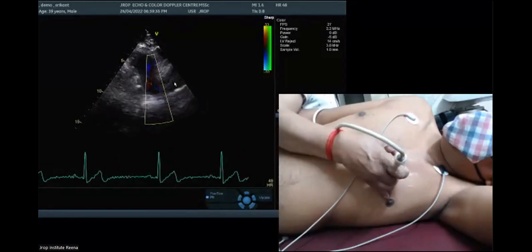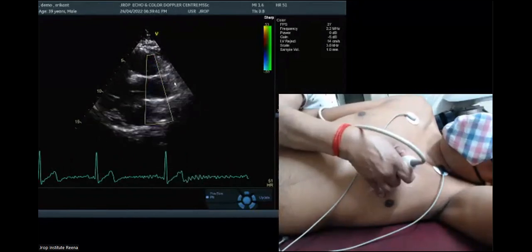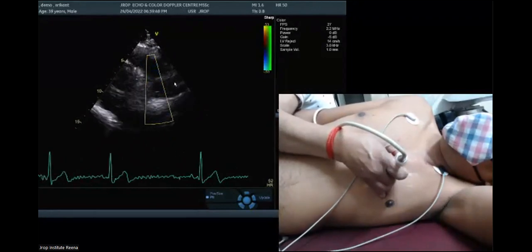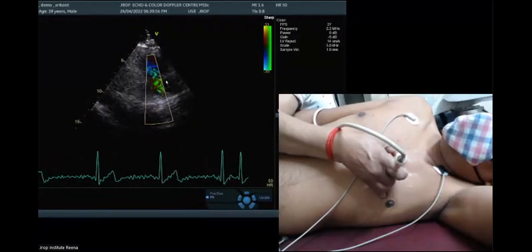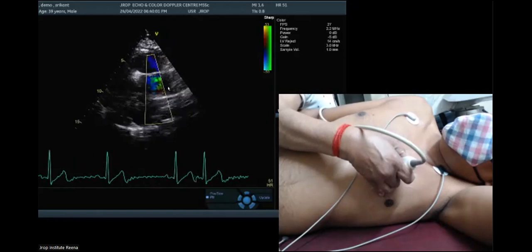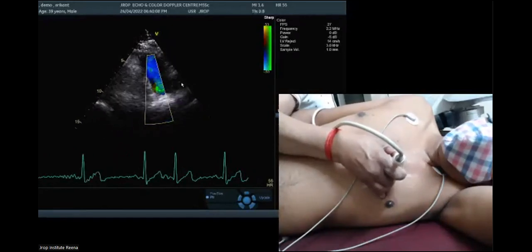Yes, sir. Okay. So go from the parasternal window and look at the cursor. It is looking towards the left shoulder. My footprint starts looking towards the left shoulder. So wherever you see my cursor, that is the descending aorta. Wherever you see color, that is the pulmonic artery. And if there is any shunt, it will be seen over here. Right? Now you can see the parasternal window. Okay, sir. And if I'm looking with the footprint towards the left shoulder, this is the pulmonic artery and this is the descending aorta.